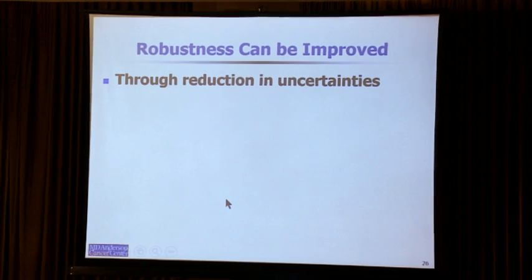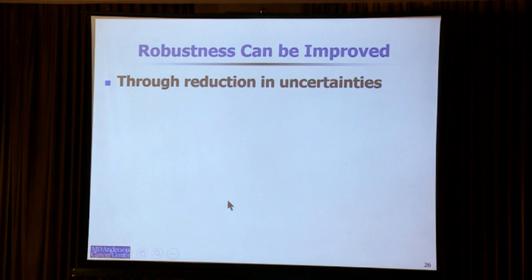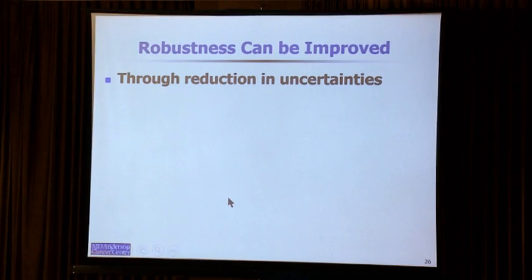So that's when you need to quantify, determine what is the robustness of the plan. And also, if it is not robust enough, you need to then use robust optimization. Robust optimization, by the way, cannot be used for passive scattering. It can be used only for scanning beam and IMPT. Just want to mention that.